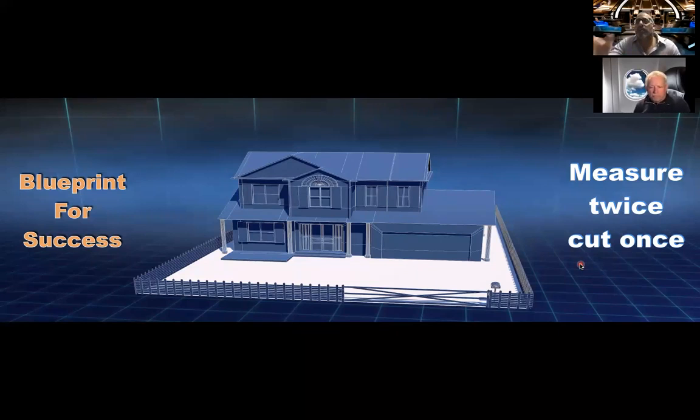And we can do that in a freehand approach. We can do it in a template assisted approach where we use maybe some kind of a stent to help guide us in place, or we can use it with a static guide or a virtual dynamic guide.